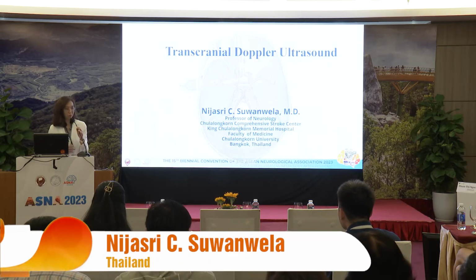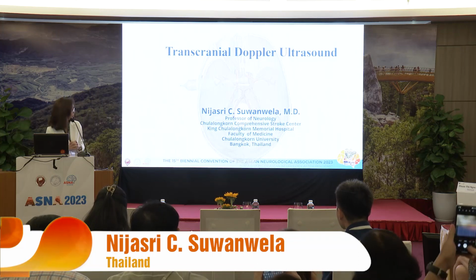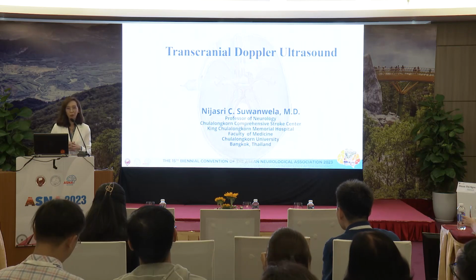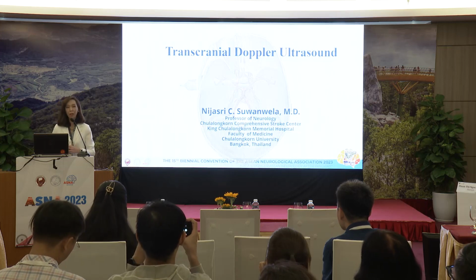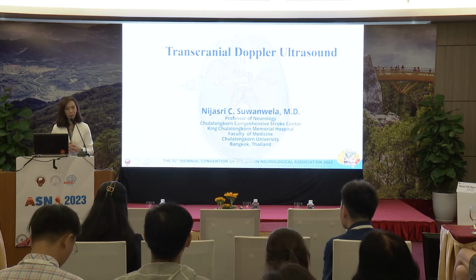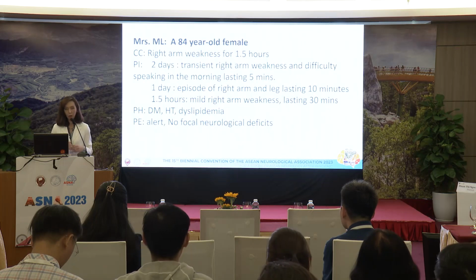So, I think for the better flow, I'll just move on to the TCD part. My life is much easier after Dr. Romani has already mentioned everything. For TCD, it's pretty much similar to the TCCD, except for the blindness. We don't see the arteries, the pictures, or the anatomy, but we can still work on it. So let's start with a case.